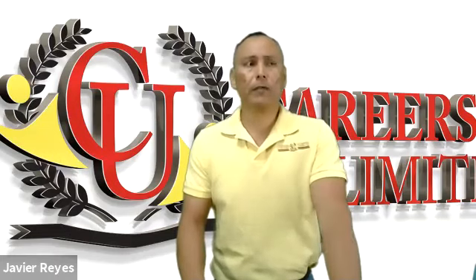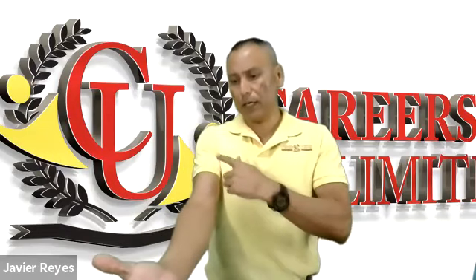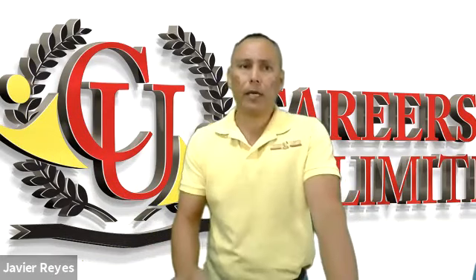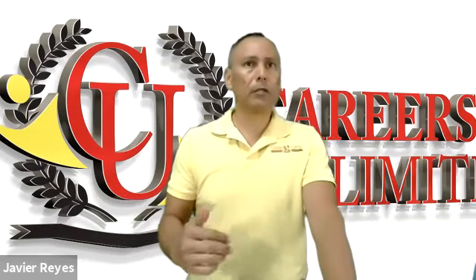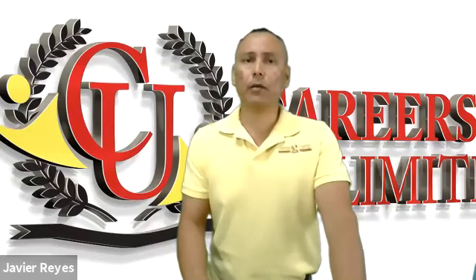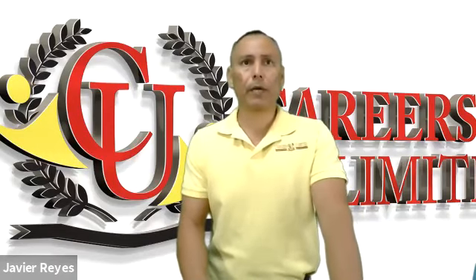If a person complains of extreme pain or numbness to the area, maybe they feel like an electric shock running down their hand, you might have poked a nerve. Remove the needle immediately, apply ice, and of course document the incident, because it may come back in a couple of months. You may be served with a lawsuit because of possible damages to the hand or injury. So again, blind probing around is not recommended at all.